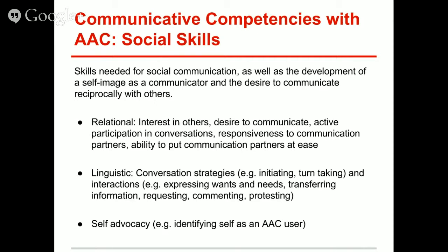As a communicator, AAC users need to learn how to connect emotionally while using their conversational skills to interact with others. As a self-advocate, we make choices and requests, but we do so much more. AAC users need to learn self-advocacy skills so they can communicate their dislikes, say no, and problem-solve technical issues that may arise with their device. For example, if their AAC device will not turn on, a student should learn how to ask a peer or adult for assistance.